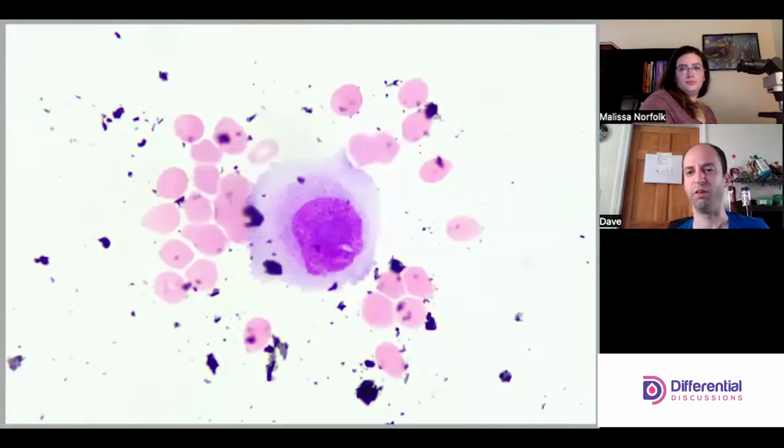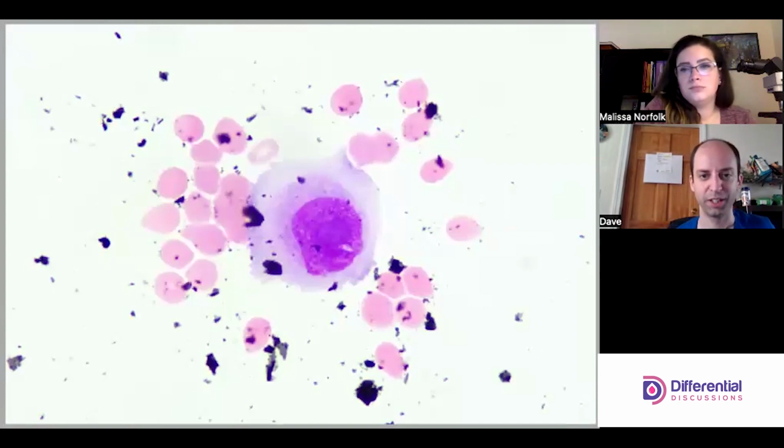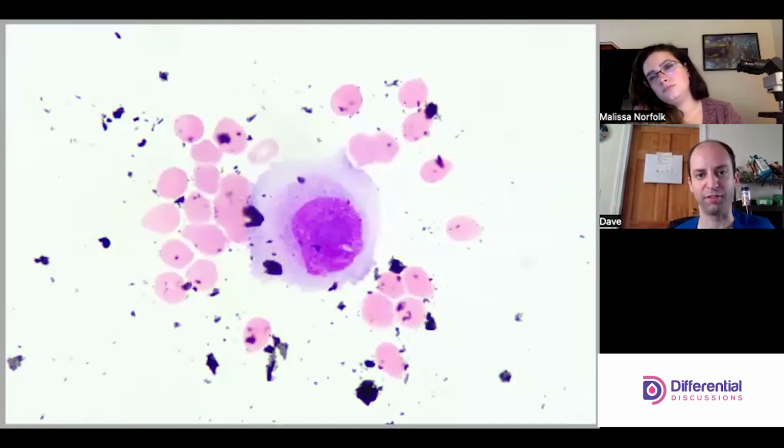And now again, what is this cell, right? Very odd to have a flat edge, that little kind of jagged corner. The nucleoli too. What is that, right?